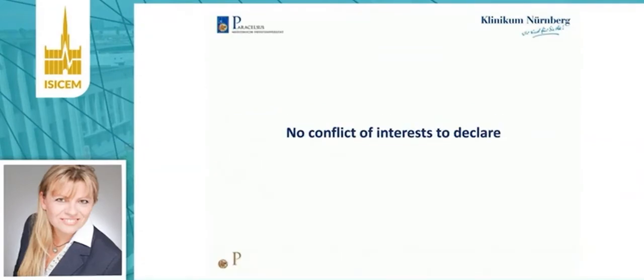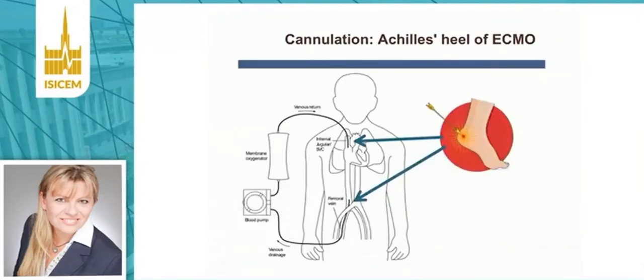I have no conflict of interest to declare, and I would like to speak about cannulation in emergency situations for VV ECMO. What we have to say is that cannulation, in the whole ECMO process and management, is the Achilles heel of ECMO.